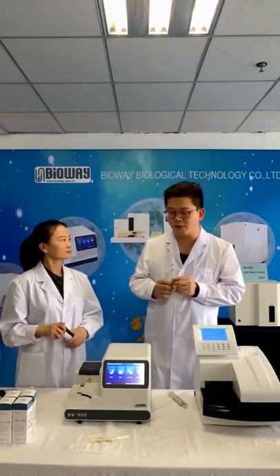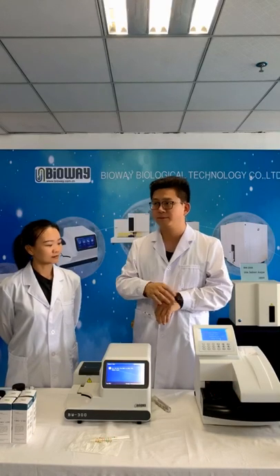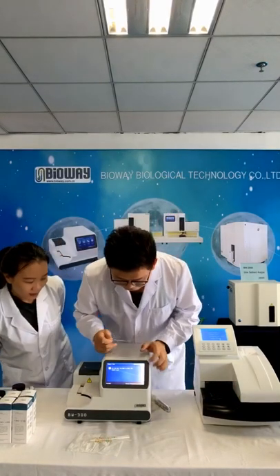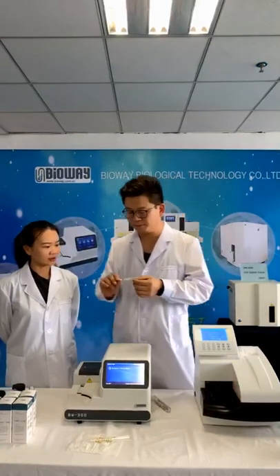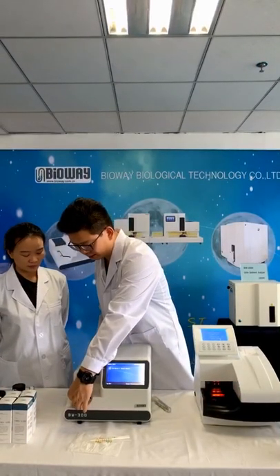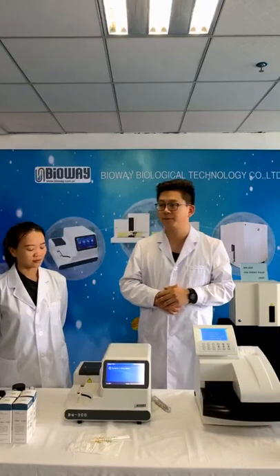So, how to use the calibration strip? There's no need to contact it with liquid or urine sample. Just directly put it into the testing area. Just like this. The machine starts working, right? Yeah. Just put the strips here, and it works. It's going to take some time.